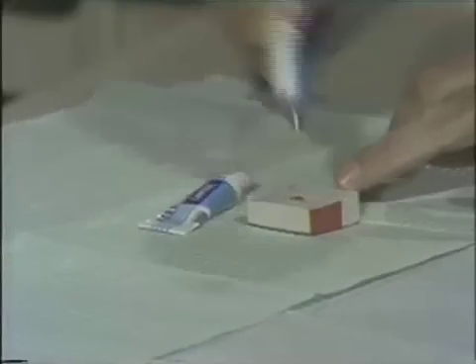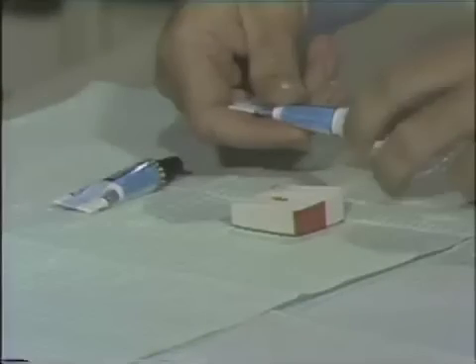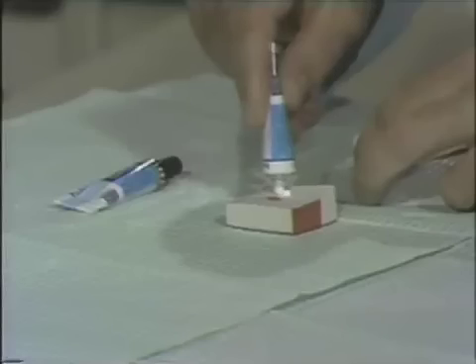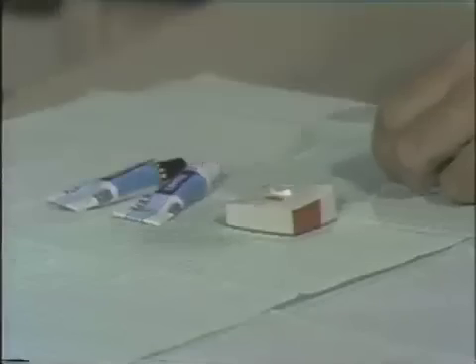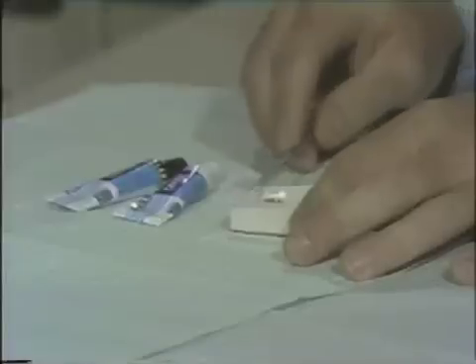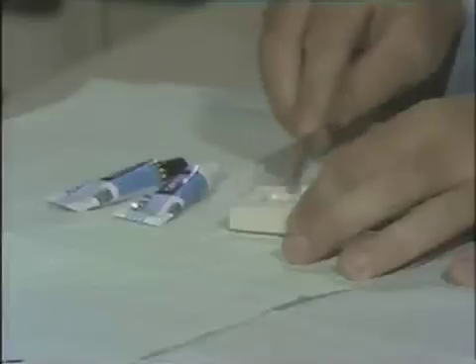We will use Cavitec, which is a zinc oxide eugenol preparation, to place against the deepened portion of the axial wall. We are hoping then that the zinc oxide eugenol will be an obtundant for that pulp. You've all mixed Cavitec, as we do here, very quickly, very smoothly, very simple to use.